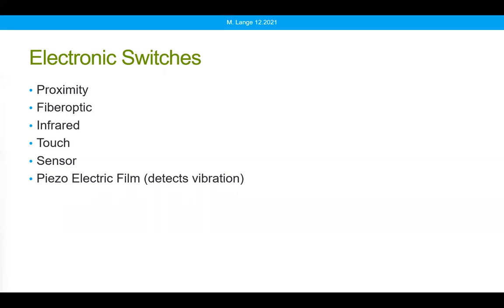So yes, and I don't think I have that in there because it's actually a mechanical switch, so I should. Thank you for bringing that up. It's an eye blink switch. And another question here. Sorry, I missed a few of these questions in the chat box.